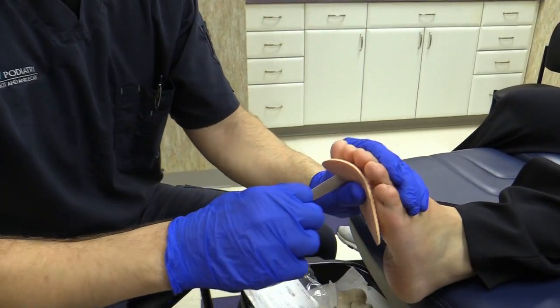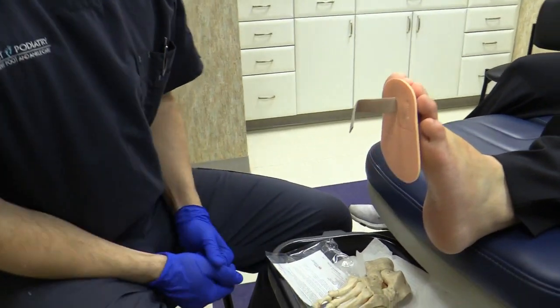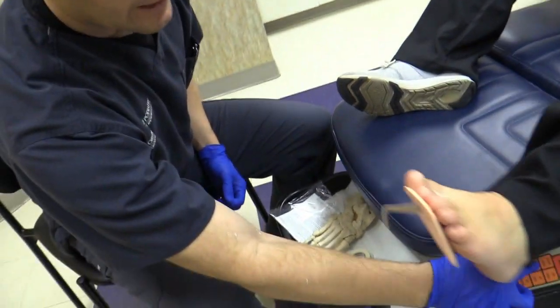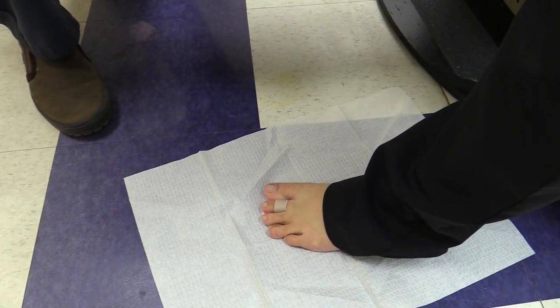You're just going to slide the splint over the toe, pull on the strap, and then put some weight on the foot to demonstrate. And that's it.